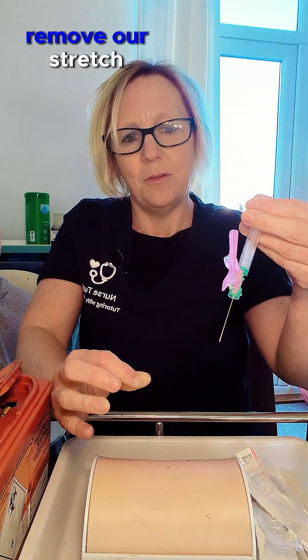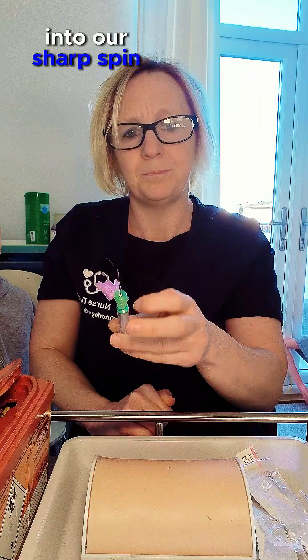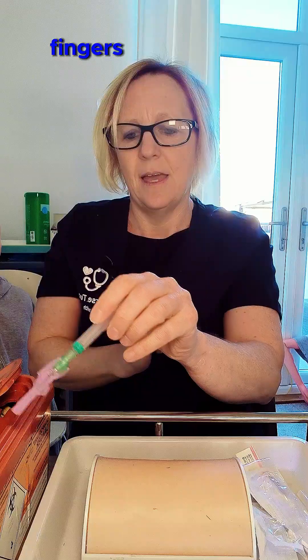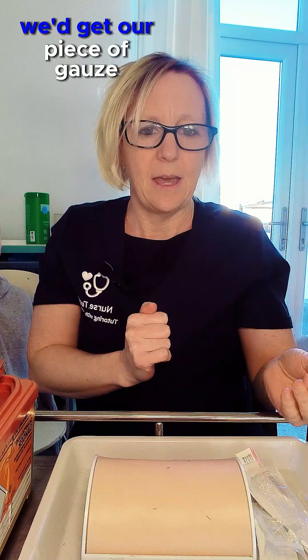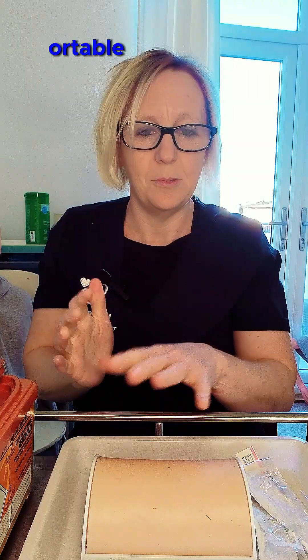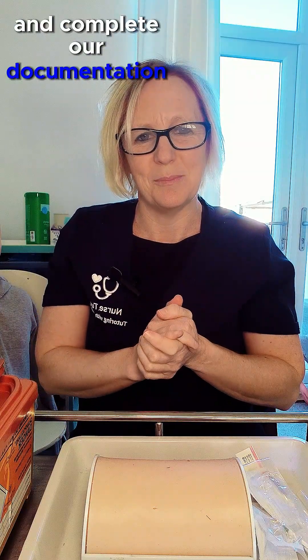We remove the needle and release our stretch, then put the needle directly into the sharps bin. We can cap off the needle on the side of the sharps bin — make sure you don't do that with your fingers. Put everything into the sharps container, then get a piece of gauze and place that over the area without massaging the site. Check the patient is comfortable, put the covers back on, decontaminate hands again, and complete documentation.